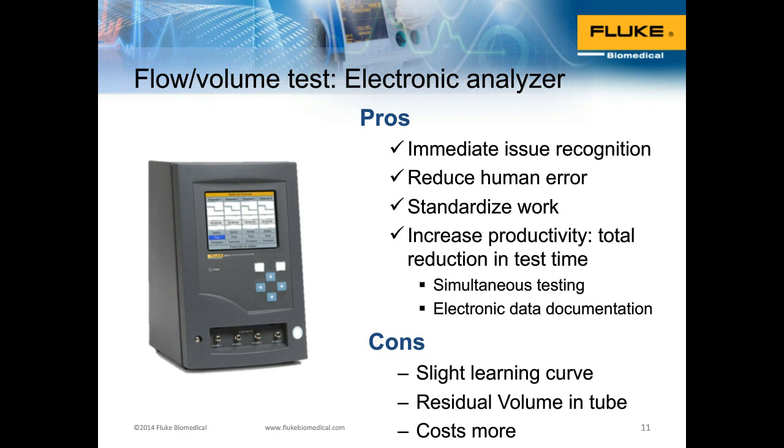Now, with an analyzer, there is a slight learning curve because most of these are very, very easy to use. But if you're going to get into complexities of trend analysis and data analysis, there'll be a little bit more learning. But the returns you get in terms of time later on and in terms of accuracy outweigh the cons related to an analyzer.